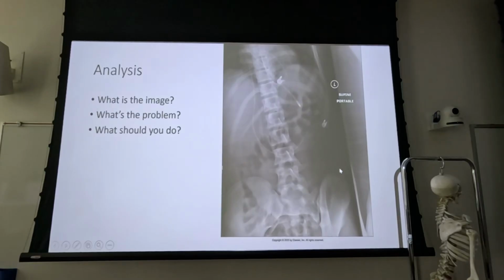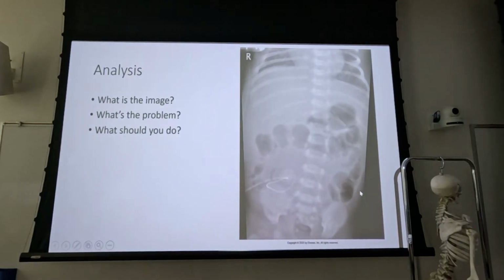Only use part of your image receptor. You could say, well, the patient moved themselves off the image receptor. Okay, and they took the collimation with them, right? No, you did this. All right, it's a magnification. Divergence of the central ray magnification. So they've got rotation, they've got mispositioning, it's just a mess.